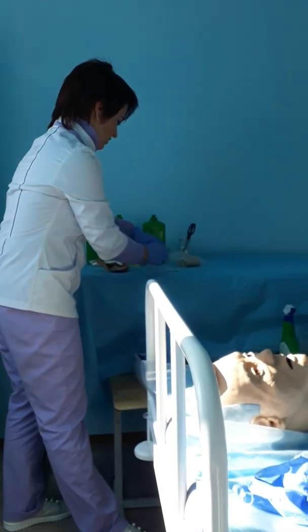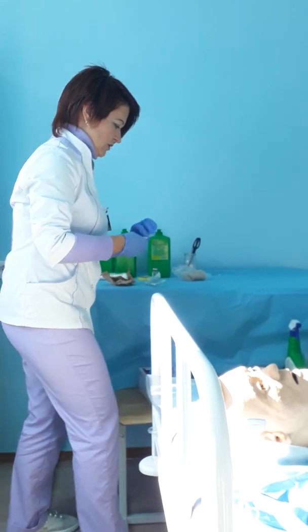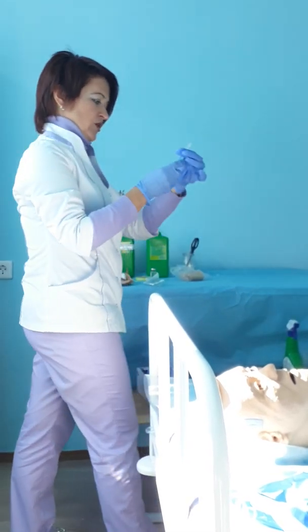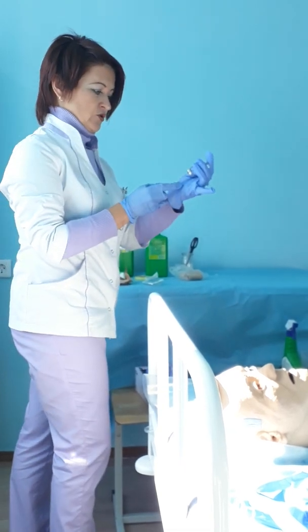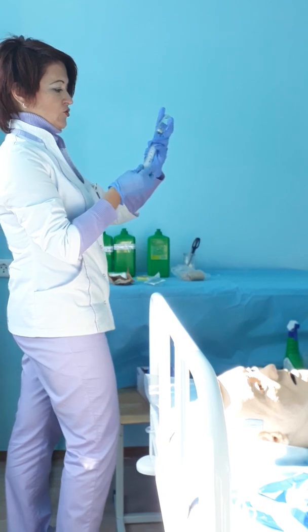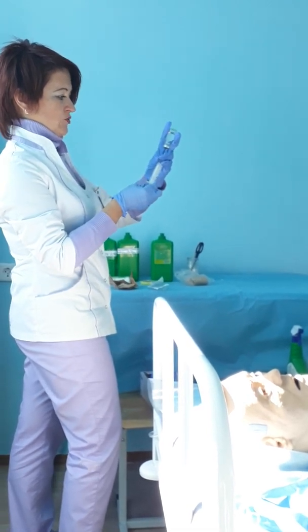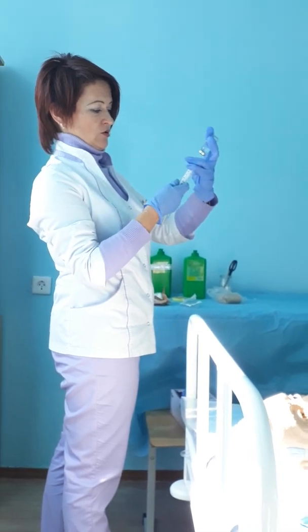Open the additional needle, take the syringe, connect, check, remove, take the right position, change position, aspirate the right solution.